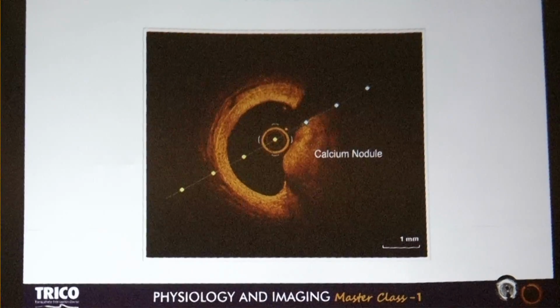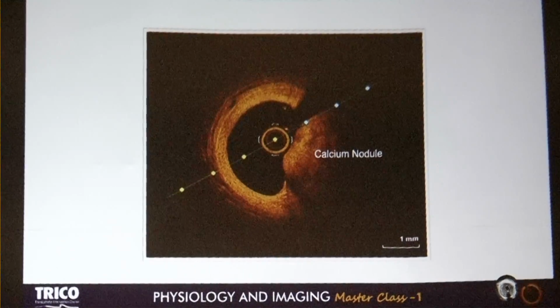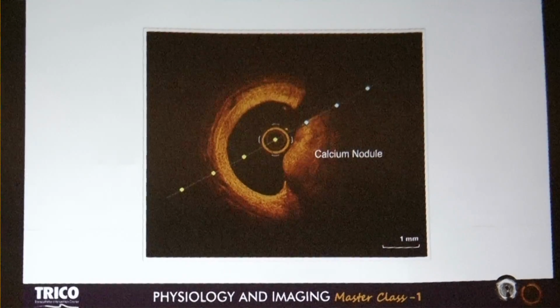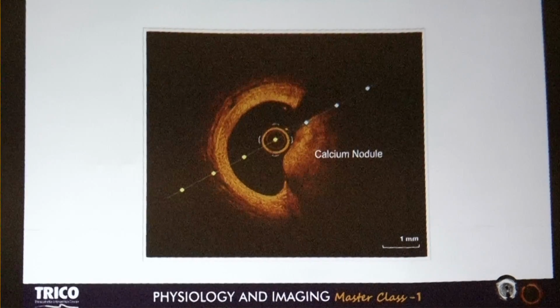Any comment, Abhiram? So this was a blunder, and the message is: spend good time interpreting the image before straight away jumping to the conclusion.